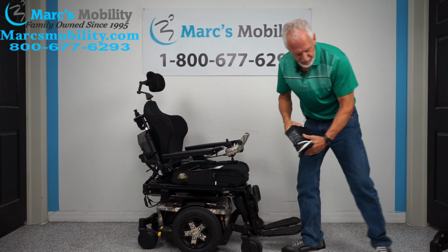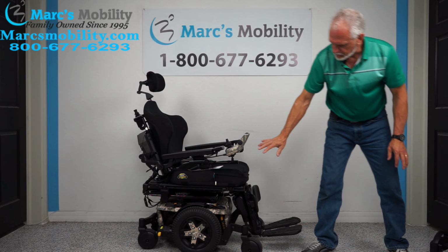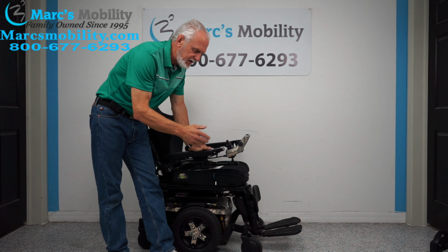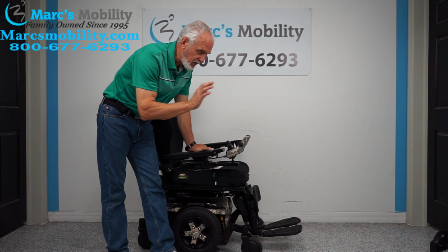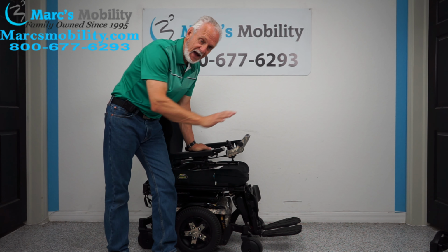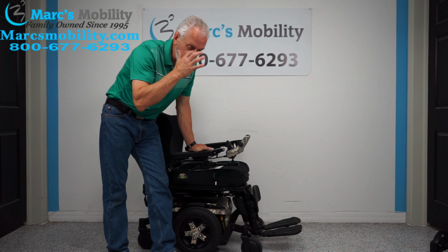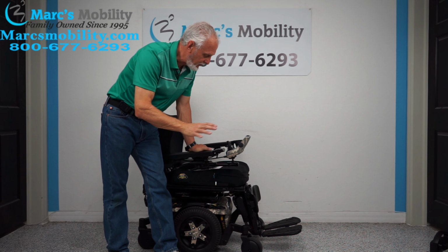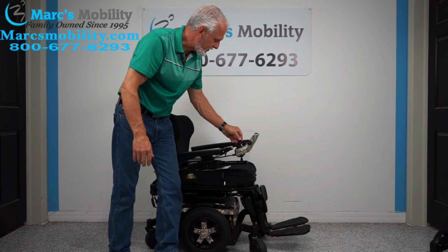Okay. These chairs have 2 batteries. They have a distance of about 15 miles on a battery charge. That's up to 15 miles. So if you're outside, you're going uphill, you're in the grass, you're using the electrical function, you're going fast, you're not going to get 15 miles, but you're going to get a long 10 miles plus, but the distance varies for everybody, okay? So let's recap.